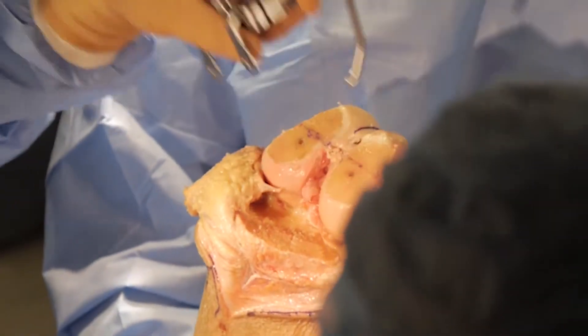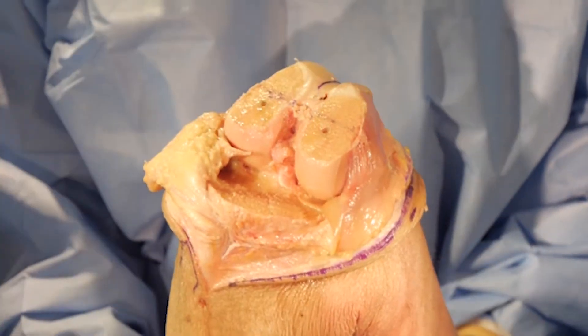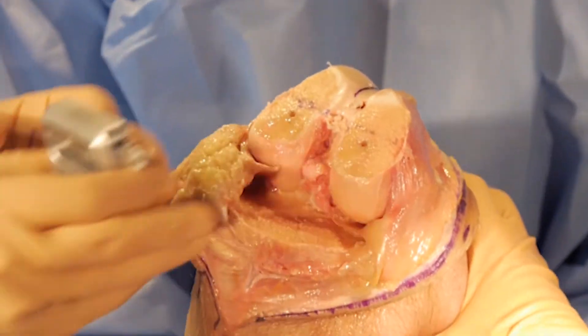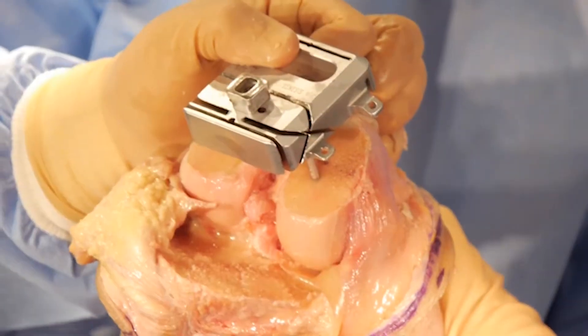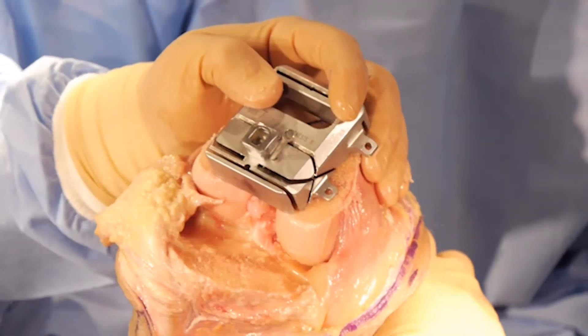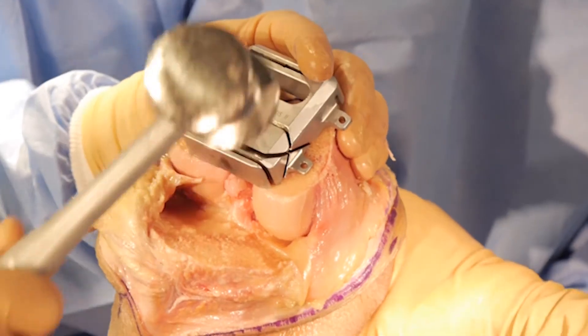This is your last chance to check your rotation and make sure you like it before you start cutting. I do like it, so at this point I'm going to put my 4-in-1 cutting guide onto the distal femur. I use one side pin to hold it and add one extra additional pin.